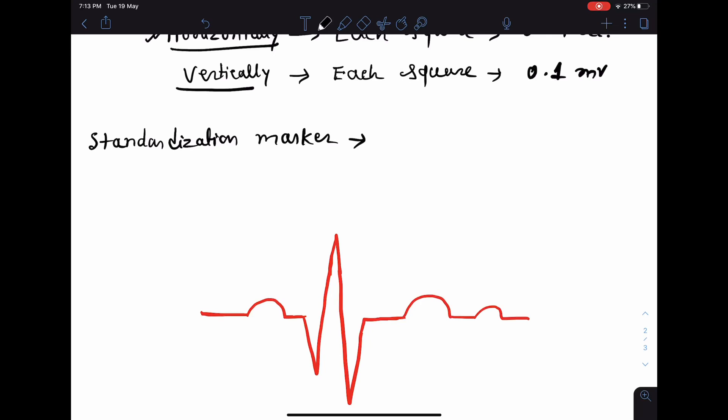Now whenever we are going to read an ECG, first of all you should have a look at the standardization marker, which is also known as calibration marker. The marker will look like a square wave with 10 mm of amplitude. If the amplitude of the standardization marker is either more or less, then the amplitude of P wave, QRS complex, and T wave all will be either larger or smaller. So it is very important that you should look at the standardization marker of the machine and then comment on the ECG.